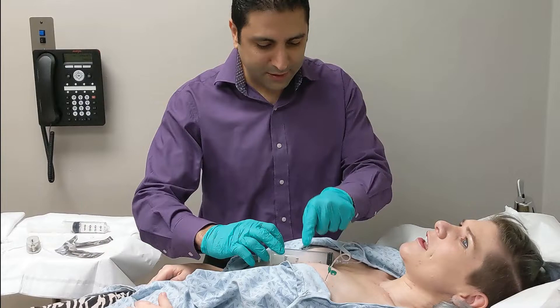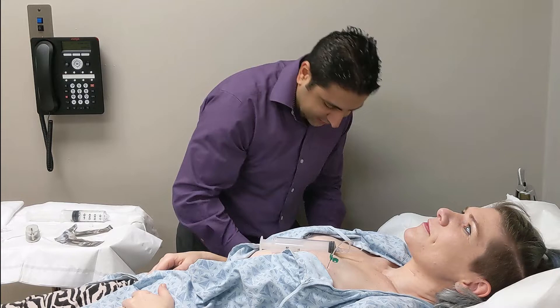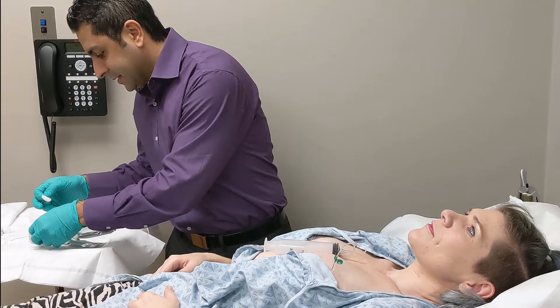Does that feel okay? Yeah. Sometimes I put more than 50 cc's in there, but this is your first fill. Because this is your first fill, I like to maintain it at a lower level. As time goes on, we may increase it.